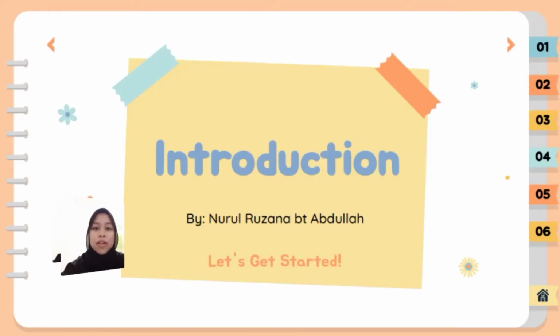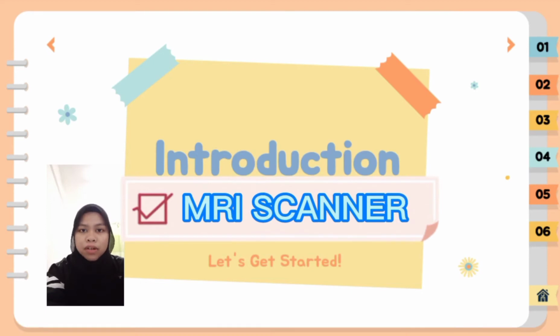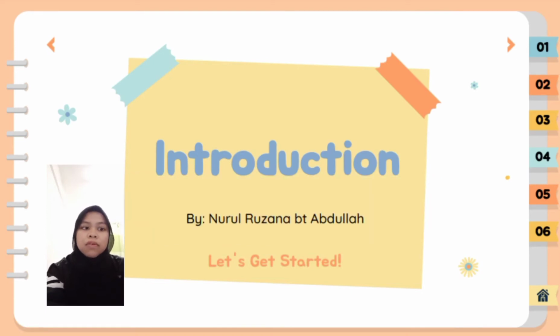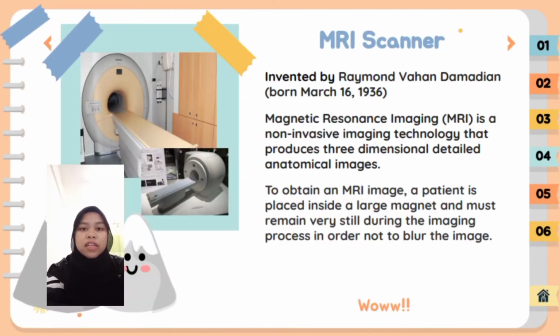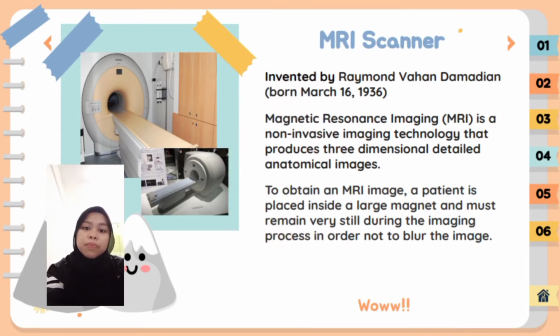Assalamualaikum warahmatullahi wabarakatuh. I am Nurul Ruzana. I will present the introduction of MRI scanning. The MRI scanner was invented by an American physician of Armenian descent named Raymond Vahan Damadian. He was one of the first people who noticed differential NMR relaxation between normal and pathological tissue.